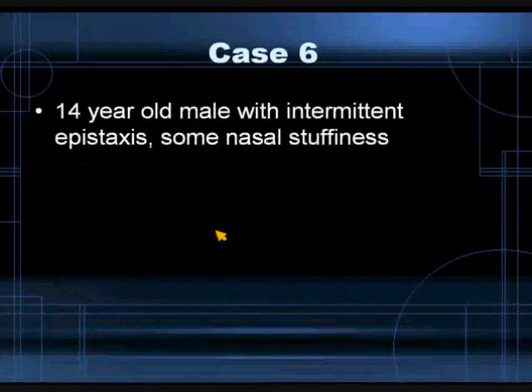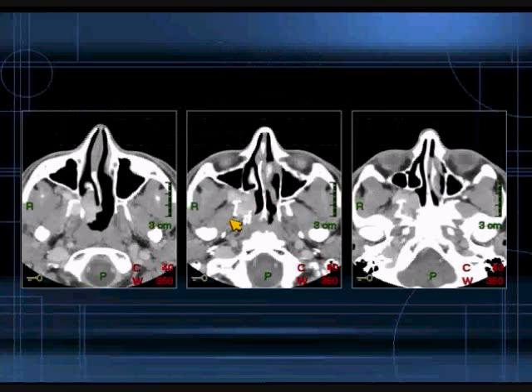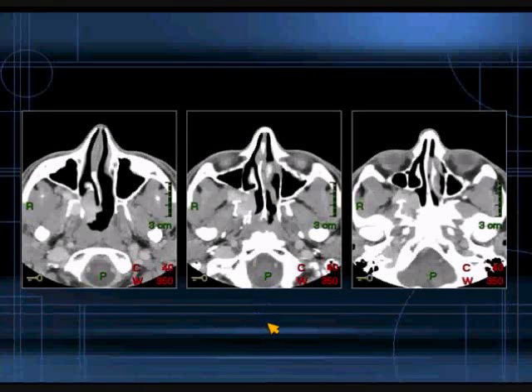Let's move to Case 6. This is a 14-year-old male with some intermittent epistaxis and some nasal stuffiness. A CT examination was performed. Here are some representative post-contrast axial images.